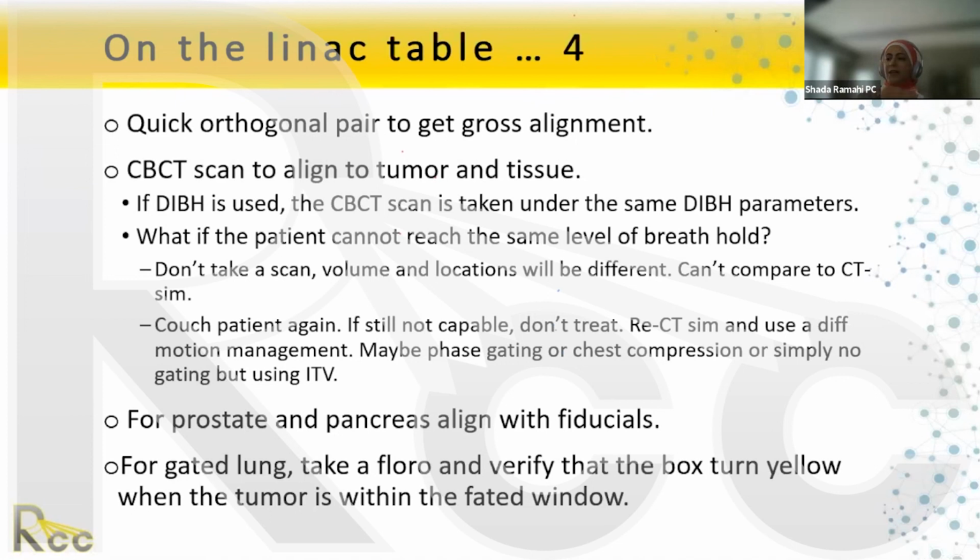So you will feel that the DIBH is different. If the DIBH is different, it means the lung volume is different, which means I cannot do my alignment. So we have to coach the patient. Of course, if we have the feedback screen, it takes most of the burden off the patient, but if they cannot really hold their breath, unfortunately we have to do a resim. We don't do it very often. Maybe I'd say once a month for DIBH stereotactic.